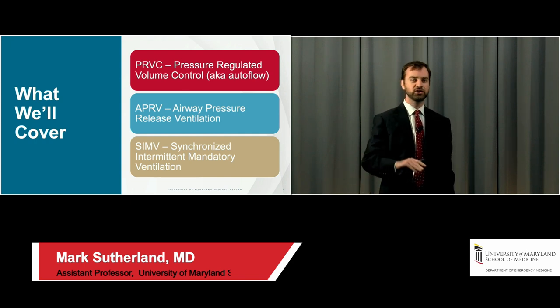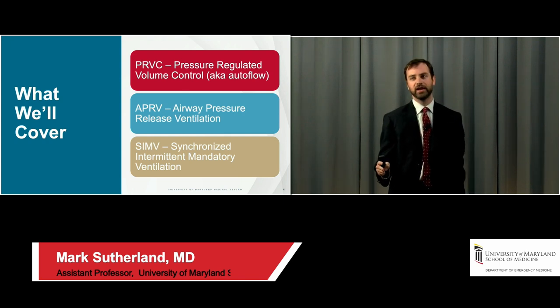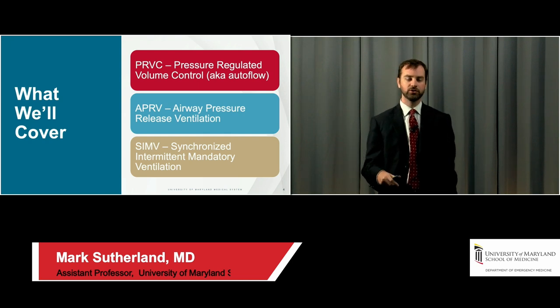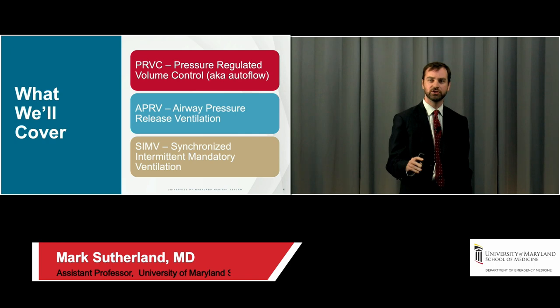The only exception to that, I would say, is I considered talking about a mode called PPS or PAV, which is used a little bit more in shock trauma, and it's a little bit more of a weaning mode, and I don't think that useful in the ED, so I opted not to talk about it. Plus, it's still pretty much a niche mode, so you really won't see patients on it all that often.